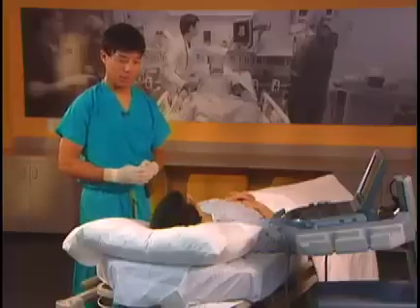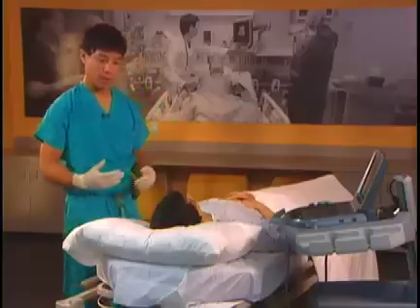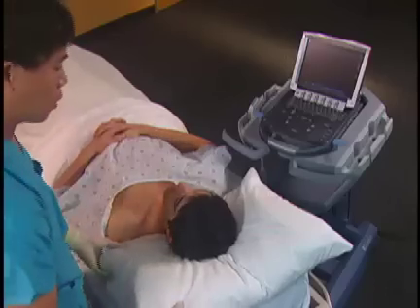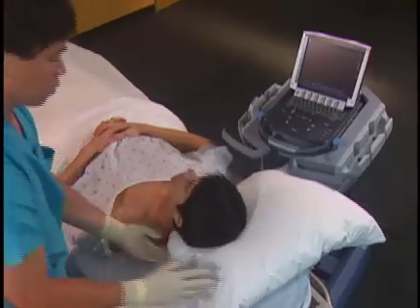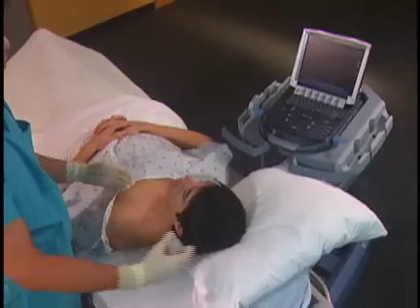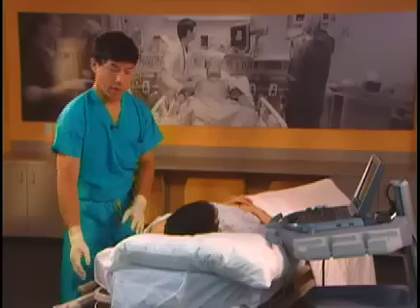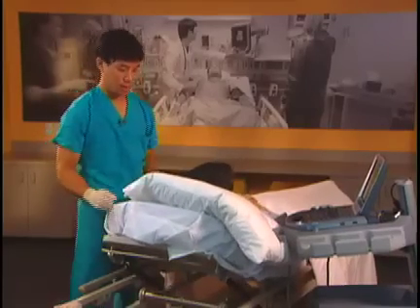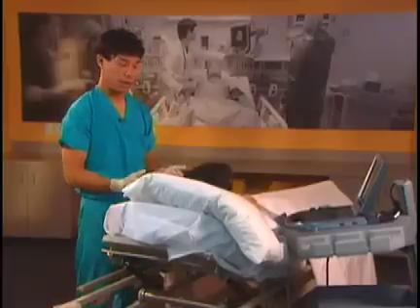To start a supraclavicular block, it's very important to position the patient properly. We move the pillow all the way over to the side so our hands have plenty of room to come from the posterior side of the patient. We also turn the patient's head away from the site to be blocked, then elevate the head of the bed 30 to 45 degrees, giving us the ability to have our hands in a comfortable position while we do the block.